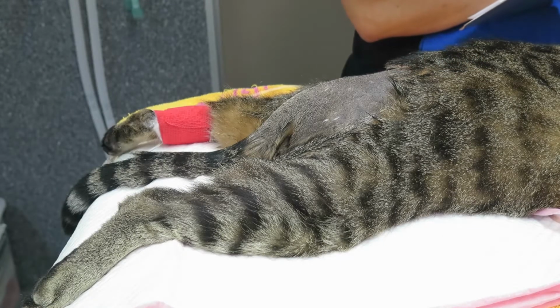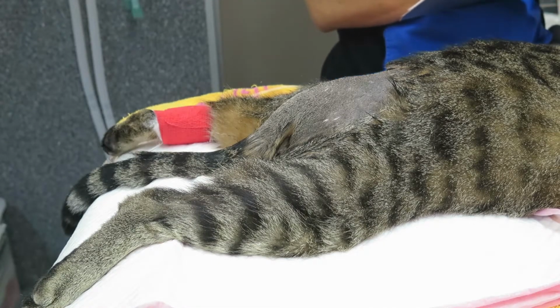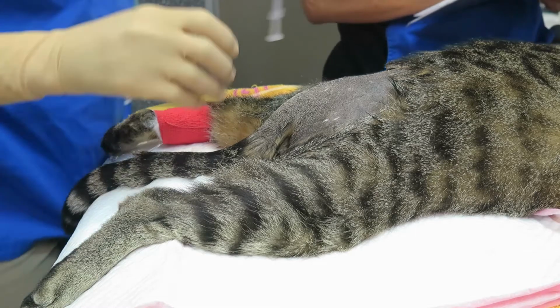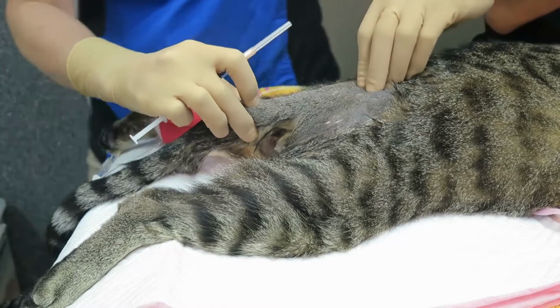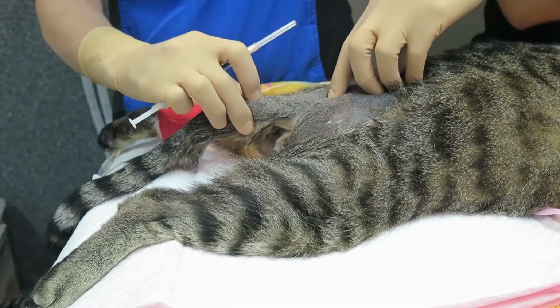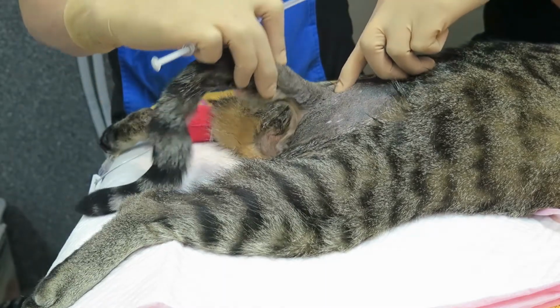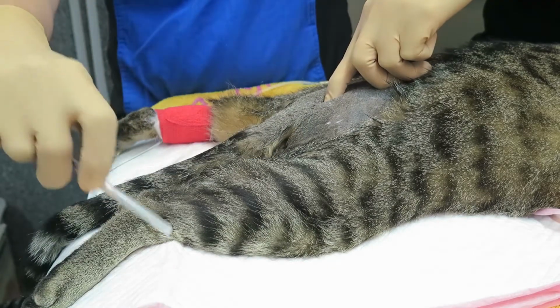The way that we do this is we have the cats in sternal recumbency, and we basically palpate the space between the sacrum and the first coccygeal vertebrae, or the first and second coccygeal vertebrae. And you can see in this video here that we're doing that by basically putting some pressure in between the joint spaces of the spine and moving the tail up and down. And the most mobile joint in that region is going to be the right location. So that will generally be between the sacrum and the first coccygeal vertebrae.